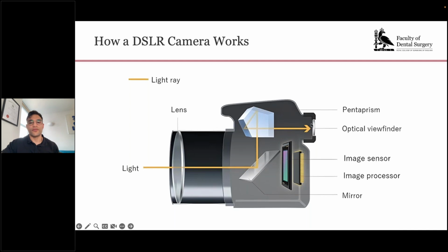And so what you see through the viewfinder, if you've set the camera up correctly, is the photograph that you'll take. And so if it doesn't look right in terms of the patient's position or the composition, when you've set the photograph up ready to be taken, it won't look right when you press the shutter release and take the photo. So the first tip is, make sure the picture is composed absolutely perfectly before you take it, because what you see is what you get with digital cameras.